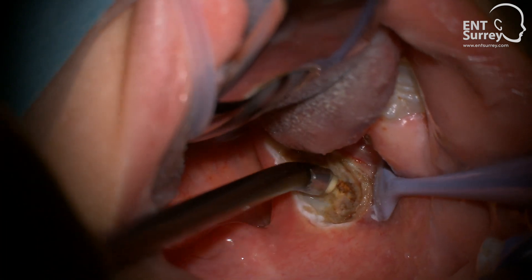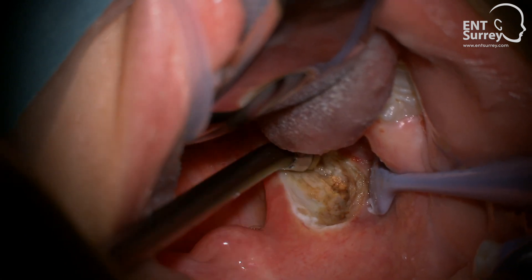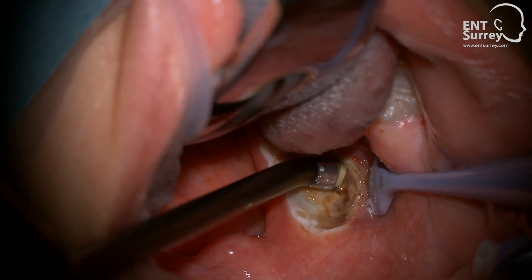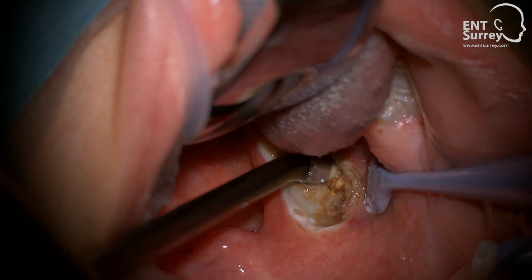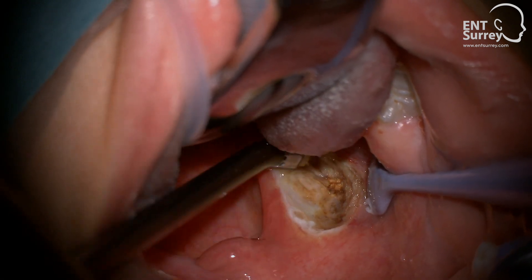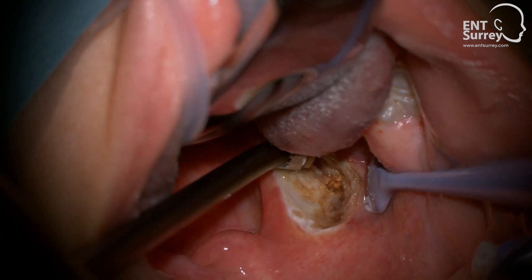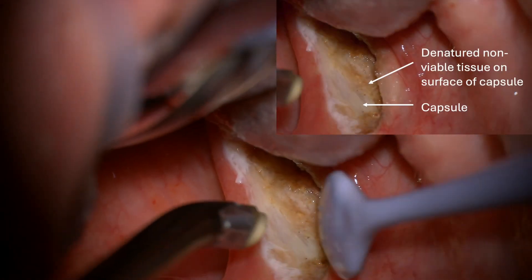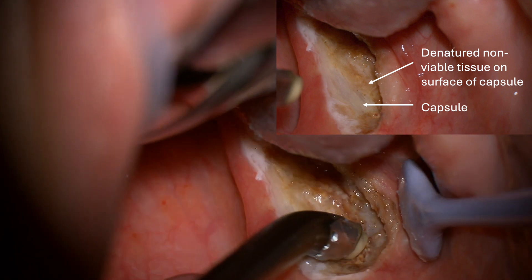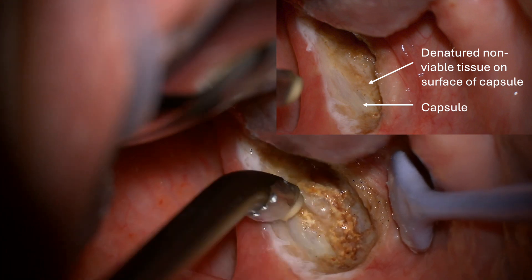When using this technique in adults, the goal is to identify the entire tonsil capsule and meticulously remove all tonsil tissue. Although tonsil tissue will sometimes change to a brown colour, the tonsil capsule is identified by its relative resistance to coagulation and by a fibrous and reticular feel and appearance. Adult tonsils tend to be more fibrous than in children, and when the capsule is reached, islands of non-viable, coagulated tonsil tissue are sometimes seen. However, the contour of the capsule should be visible underneath. These denatured islands of tissue can be left, as they will slough off during the healing process.